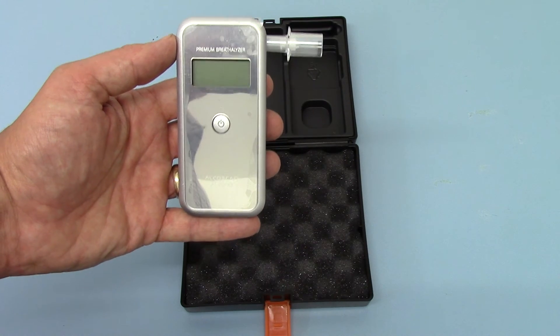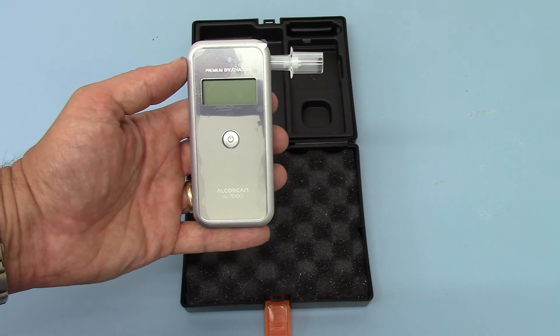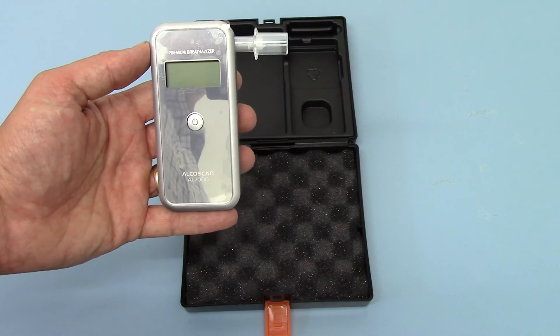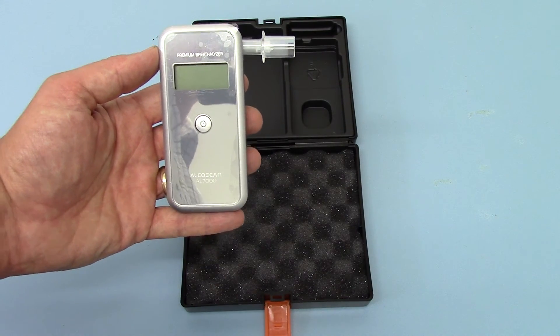If that had been above the equivalent of 0.05% BAC, we would have got a fast tone warning, because these are preset at the factory to give you that audible warning at 0.05% BAC equivalents and above. That's blood alcohol concentration.